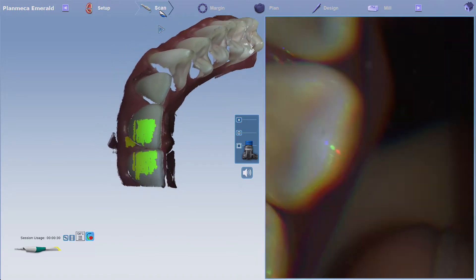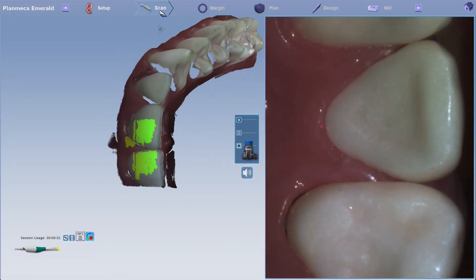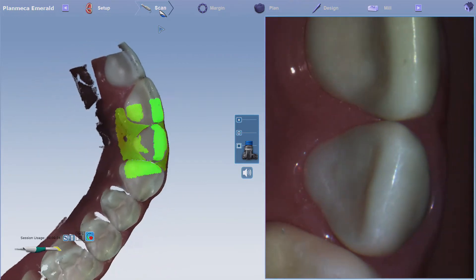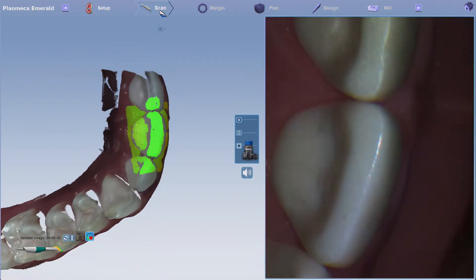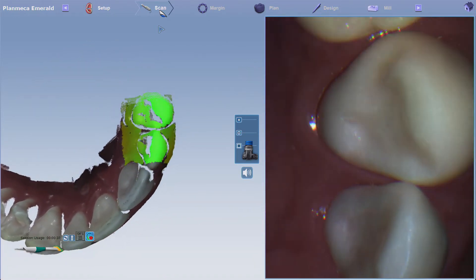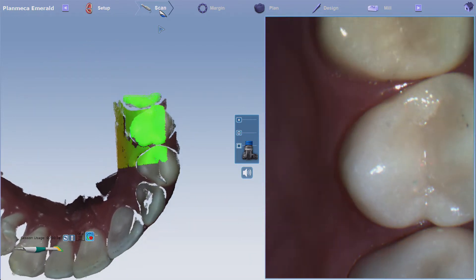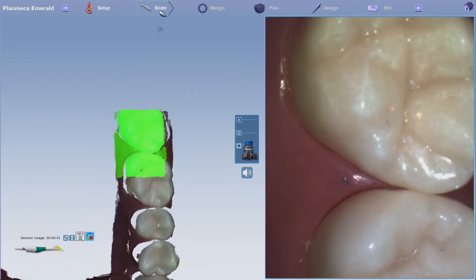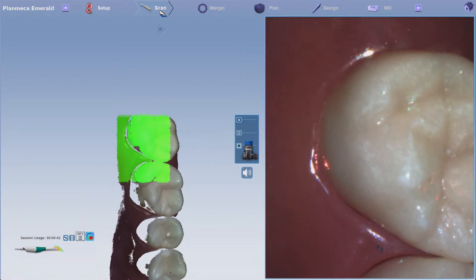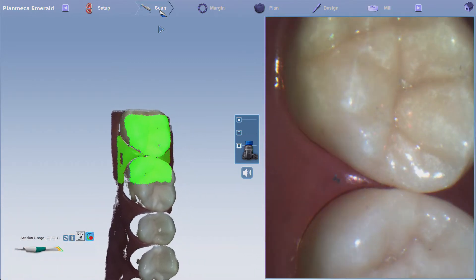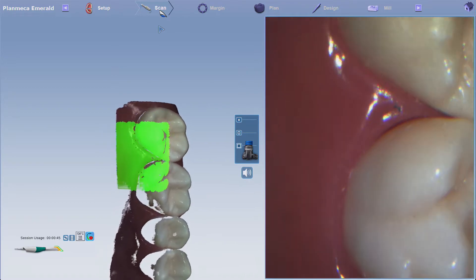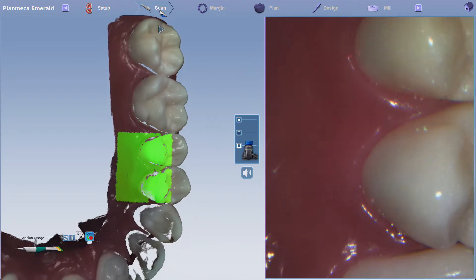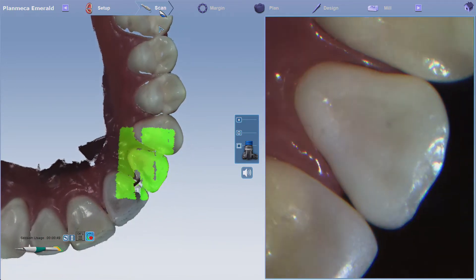Flip the scanner when needed. Start on the lingual surface — that's usually the easiest to pick up — and then scan the occlusal table, back to the lingual, and then to the buccal.